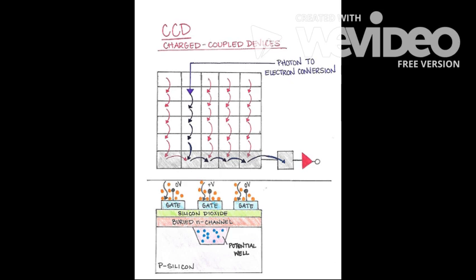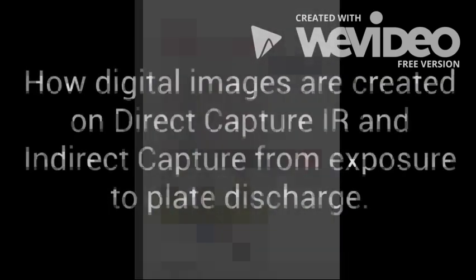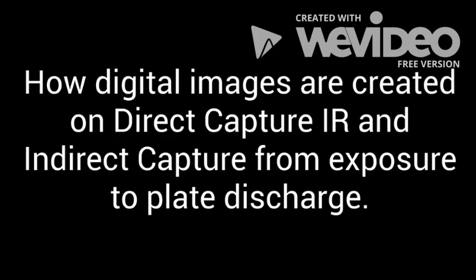A CCD is considered an indirect acquisition because it uses a scintillator and does not use a thin film transistor, also known as the TFT, which is an electric switch that allows the charge collected at each pixel to be independently transferred to an external electronic where it is amplified and quantized. The advantages of using CCDs tiled together to form a flat panel indirect capture are the high efficiency, good resolution, and high dynamic range.